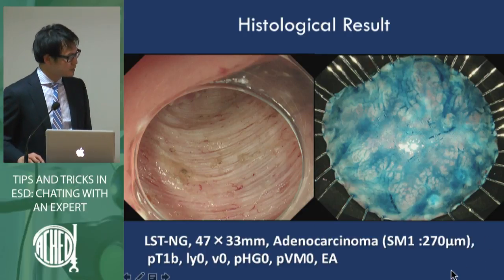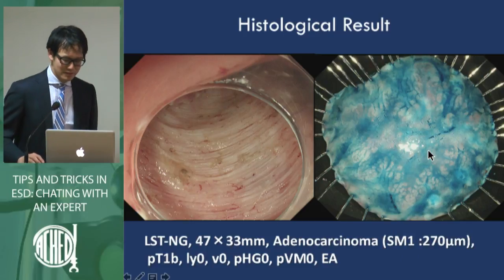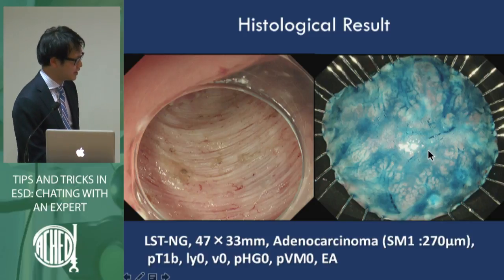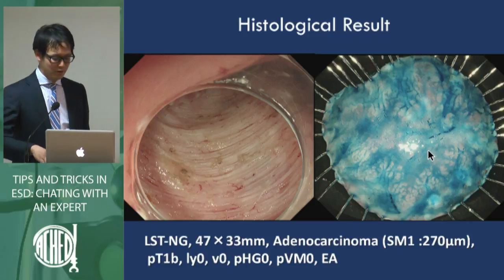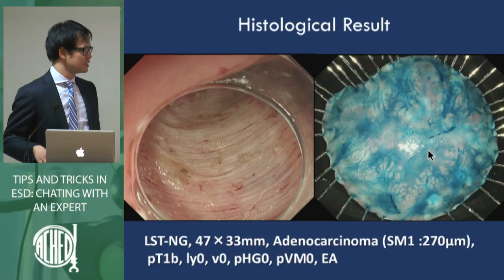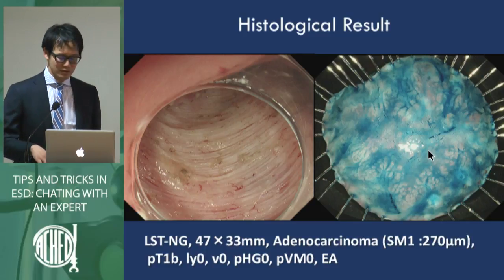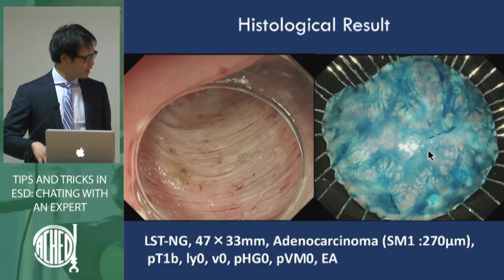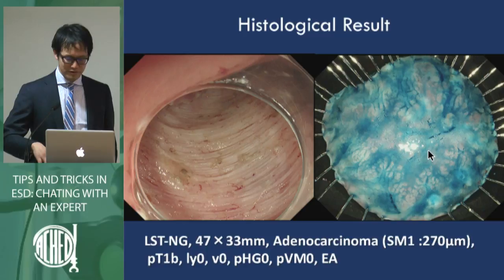So as you can see, in the center of the tumor, it invades the submucosal layer. But fortunately, this region is completely dissected, so it doesn't need surgical resection.